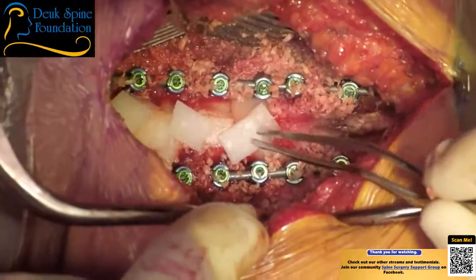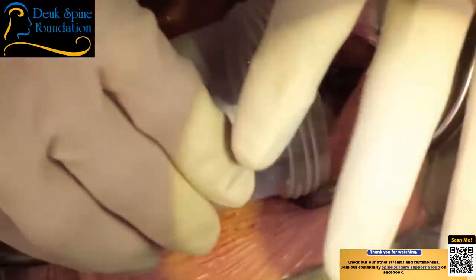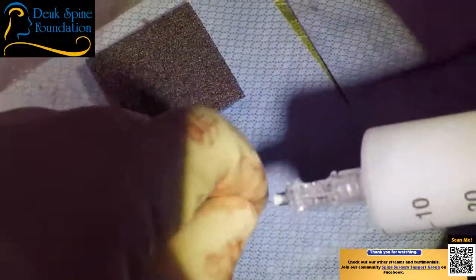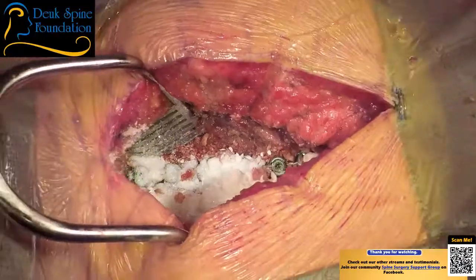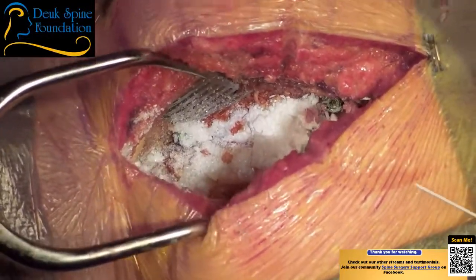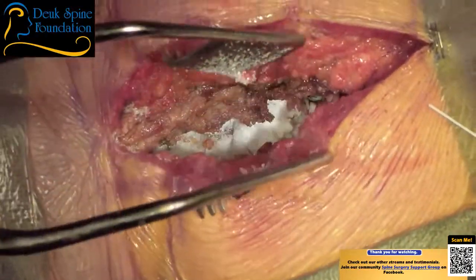This patient doesn't have a depth problem, but we've just gotten into the practice of using 500 milligrams rather than a full gram. And that's the white powder. So why do we use this antibiotic vancomycin? Well, it's simple. It prevents deep wound infections, and it really works. I've been using this now for 12 years, and we've had literally no infections in 12 years with posterior lumbar and posterior cervical surgeries. So it's pretty incredible how effective it really is.